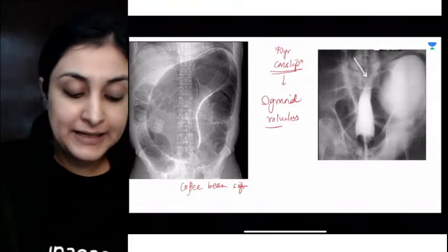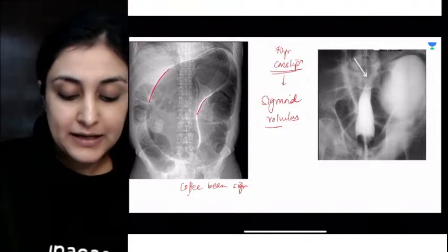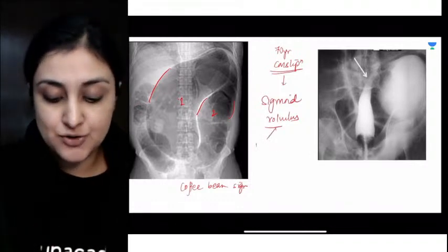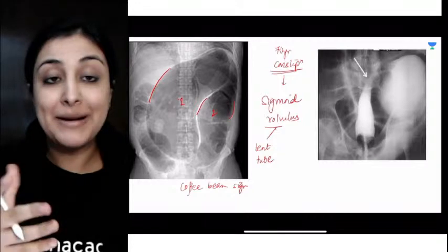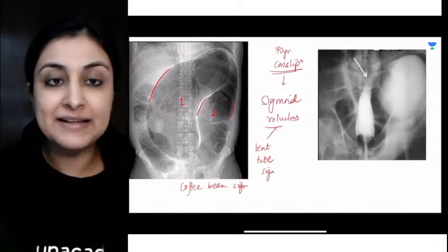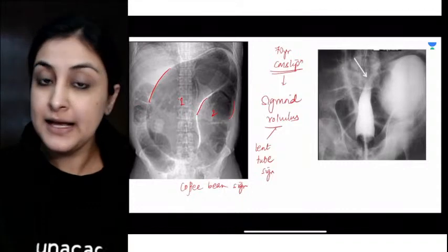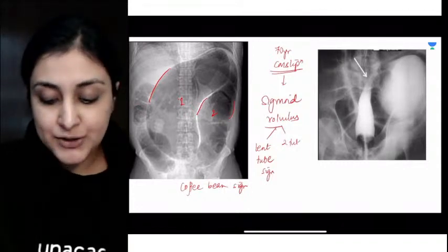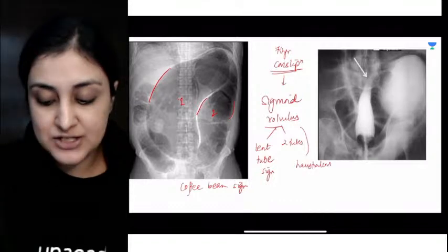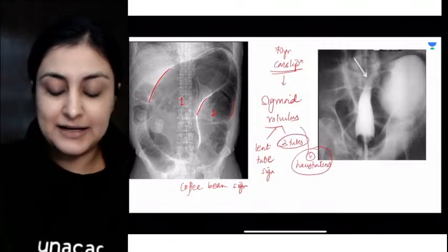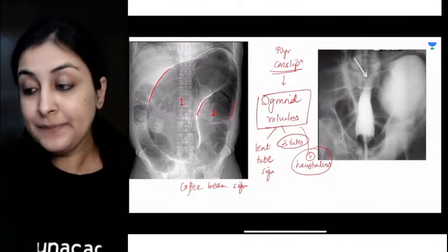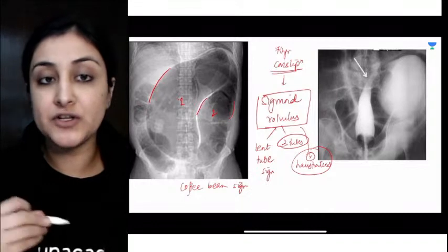Always ensure that it's sigmoid volvulus by checking two points. What two points? How many loops are we seeing? One tube here, another tube here. So this is the two tubes that we will see. Someone said it looks like a bent tube, bent tube sign. Second thing, do we see haustra? No. So there will be two tubes that you see and there will be no haustra here. So you just check these two points and then mark that the answer is definitely sigmoid volvulus.